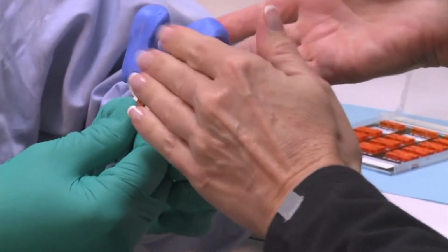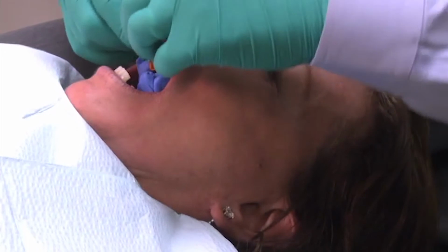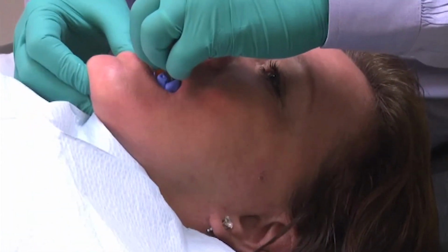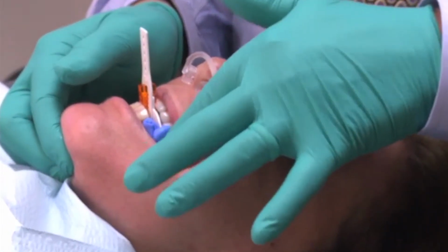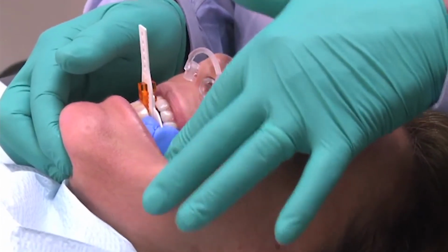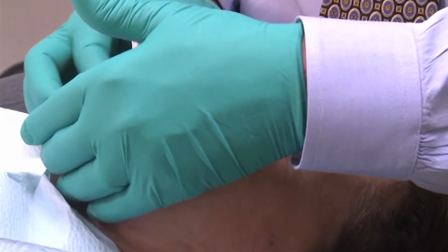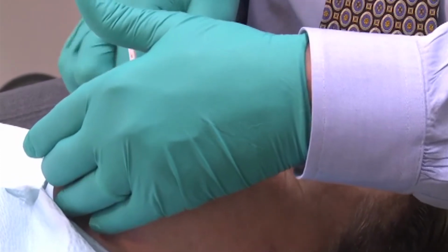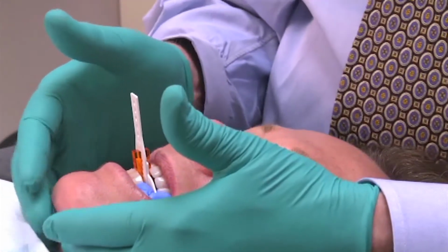Great. So we'll position the middle notch and open over her maxillary anterior teeth. Move close forward, back a little bit. Good. Kim, just put your tongue to the roof of your mouth. Good. And then I will once again take my fingers and press the putty from the back buccal vestibule into the bite fork. And we'll wait for our timer to set. And I always like to hold the patient's chin just to remind them not to open.